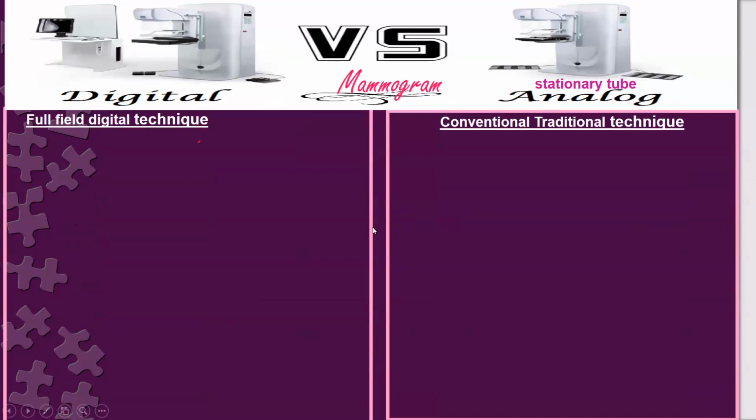So what are the differences between digital and analog, or conventional? The contrast in digital mammogram is higher than in the analog. And more details about the internal structure like Cooper ligaments.